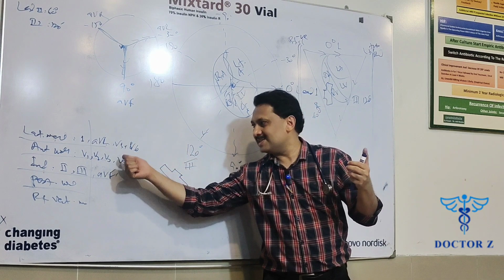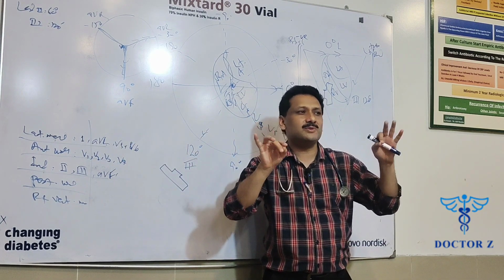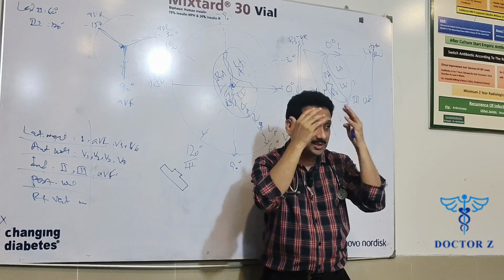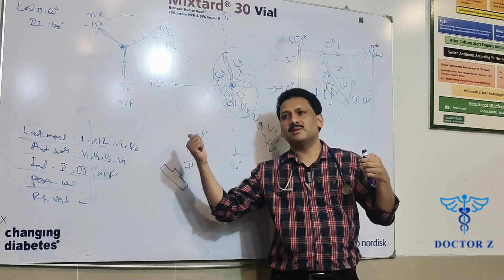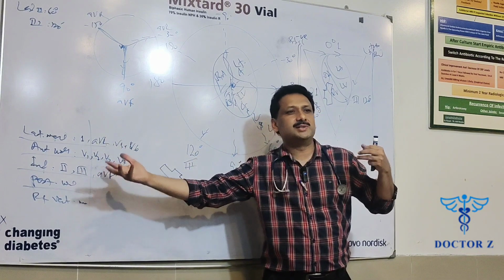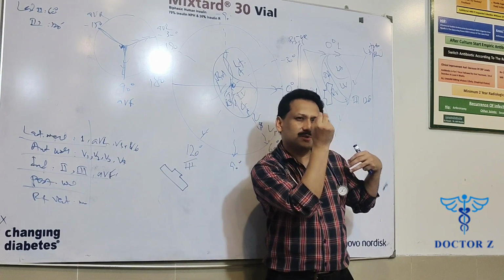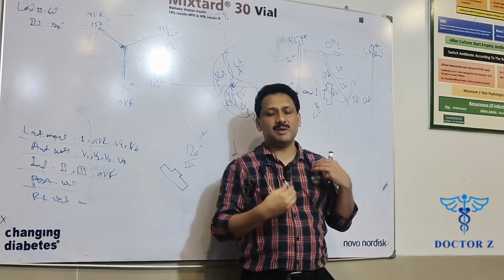So this is what we wanted to know. We wanted to know that the things which are happening inside the chambers of the heart, we wanted to interpret these changes by some means which is understandable to us, which we can see with our naked eyes. And this is what those scientists did, with the aid of these cameras, with the aid of these leads, and actually with the aid of those electrodes, as they were very good conductors of electricity, so they were just picking up those fine electric currents and showing them on that ECG paper.